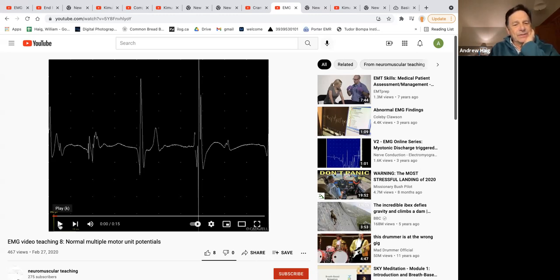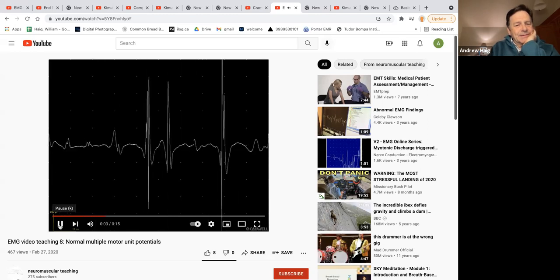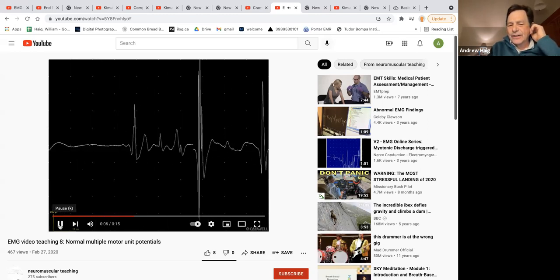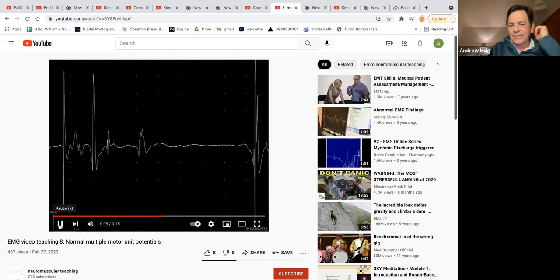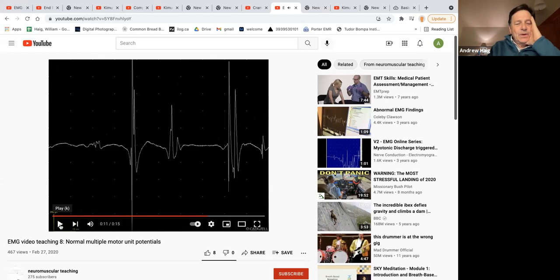So let's take a look at these under motion. It sounds crisp. They don't go thwack, thwack, thwack. Okay, so I can hear the sound from across the room and say, that's a polyphasic motor unit. These sound really crisp. They sound kind of good.